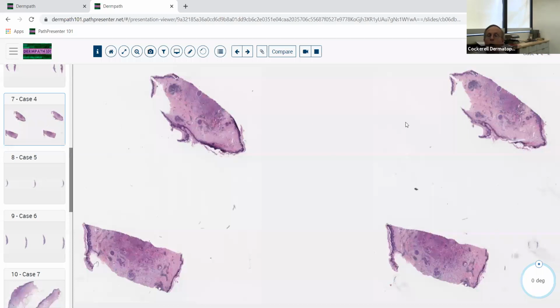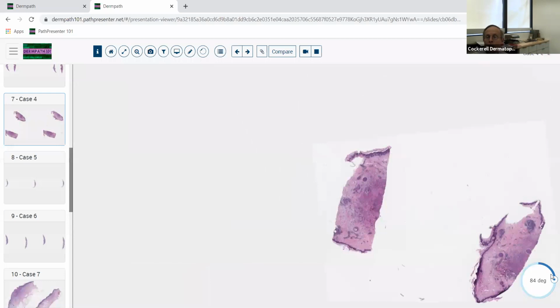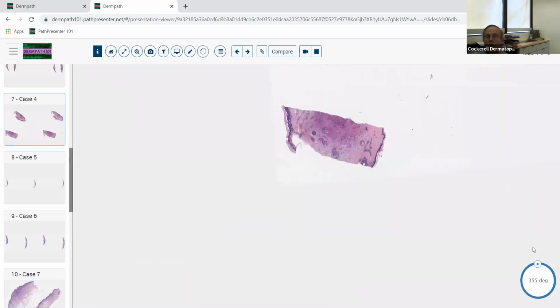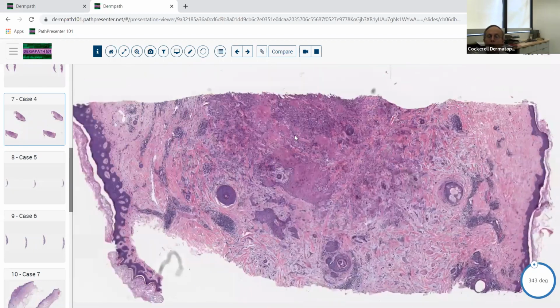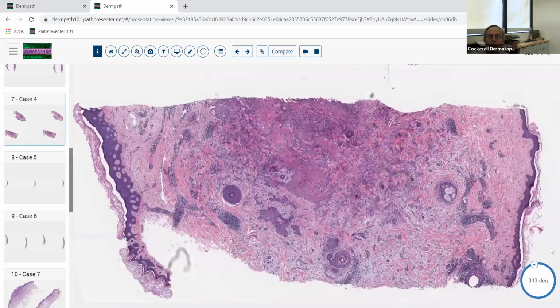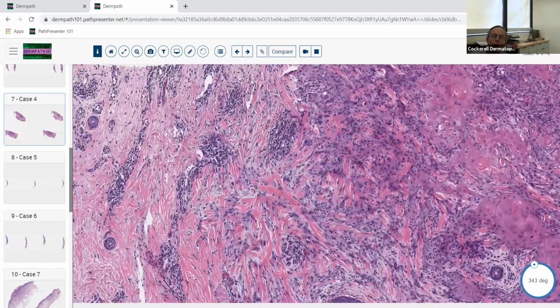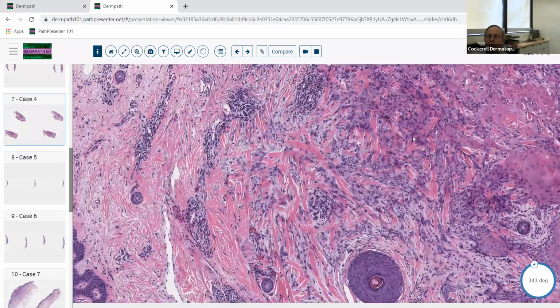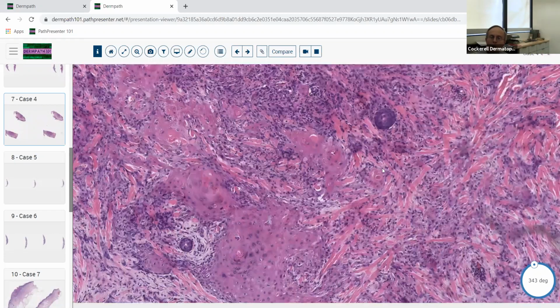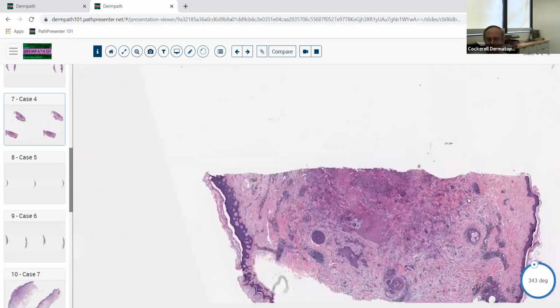Here we've got an example where we get a biopsy that's taken by punch technique. Let's go this direction on it. This is probably the way that it was supposed to look here. Not the world's best biopsy, but it's obvious squamous cell carcinoma. But notice that this is epidermis, and there's nothing contiguous with the epidermis here at all. There's no solar keratosis. There's really not a lot of solar damage in this lesion. We're basically just looking at a squamous cell carcinoma sitting in the middle of the dermis. And when we see that, we get concerned that it might be a metastasis of squamous cell carcinoma.